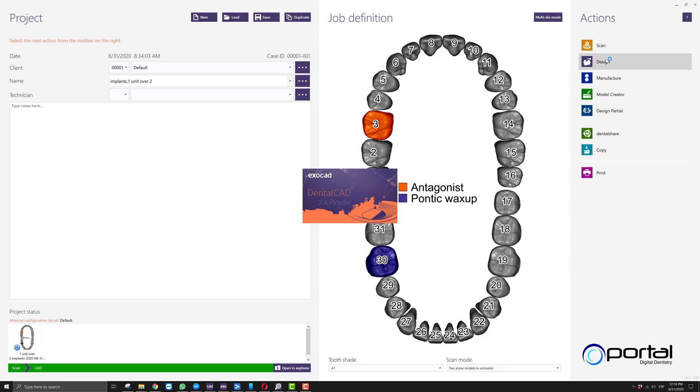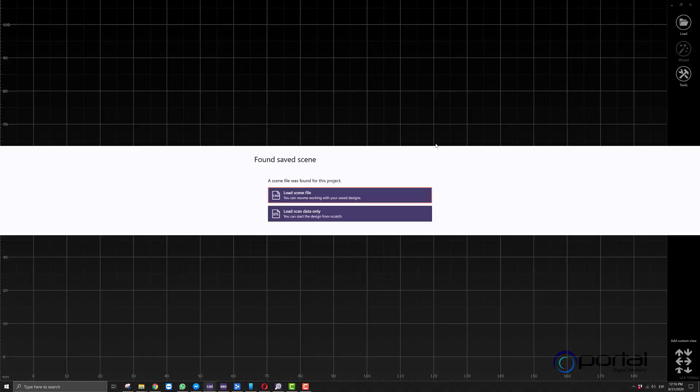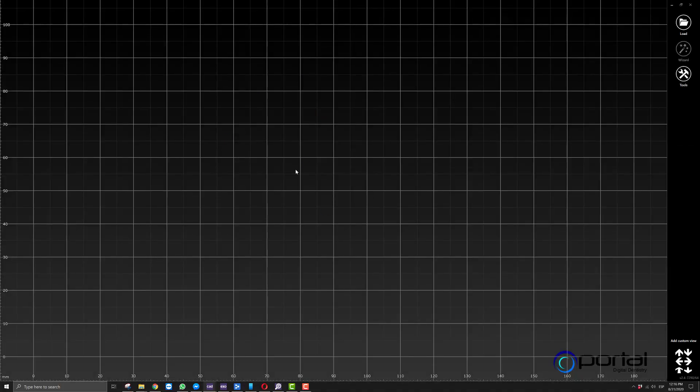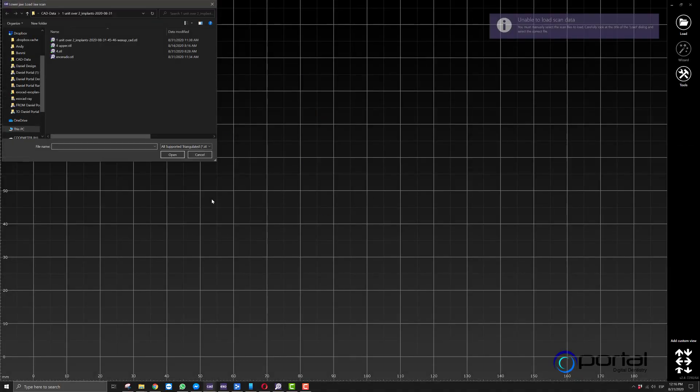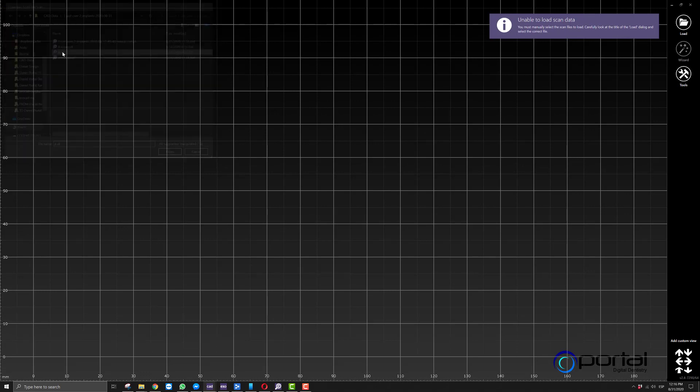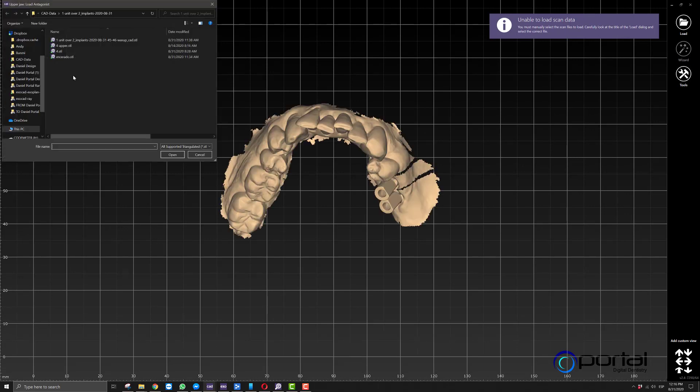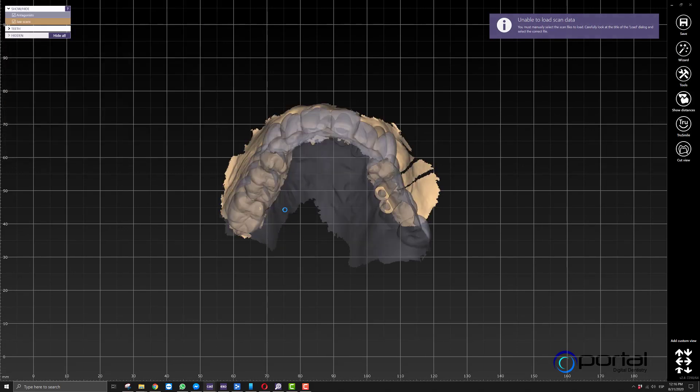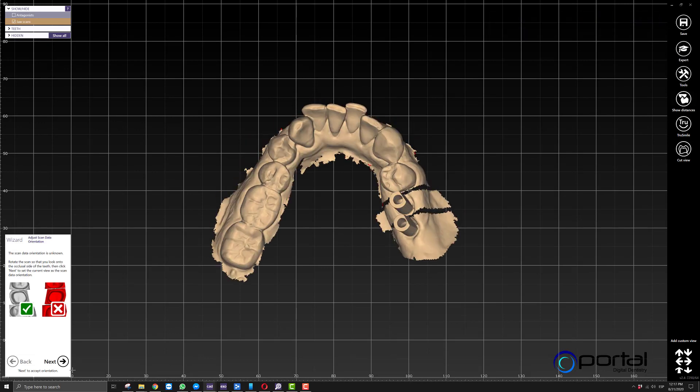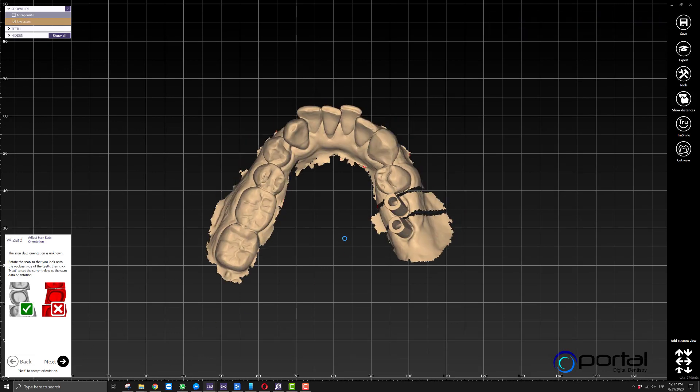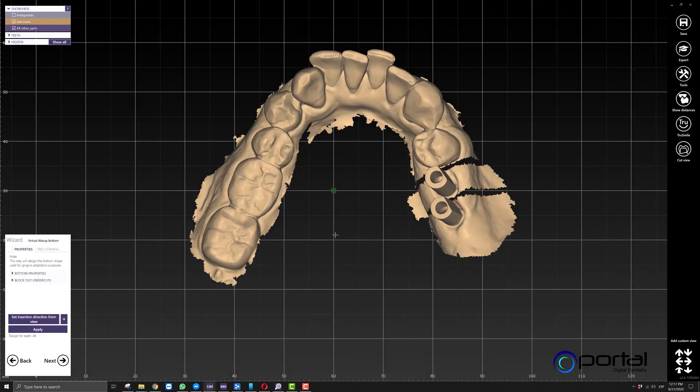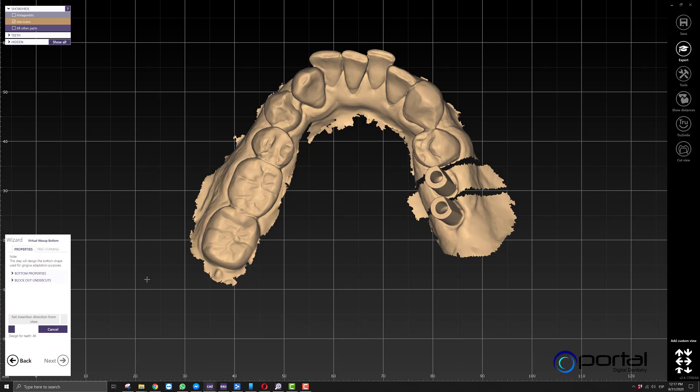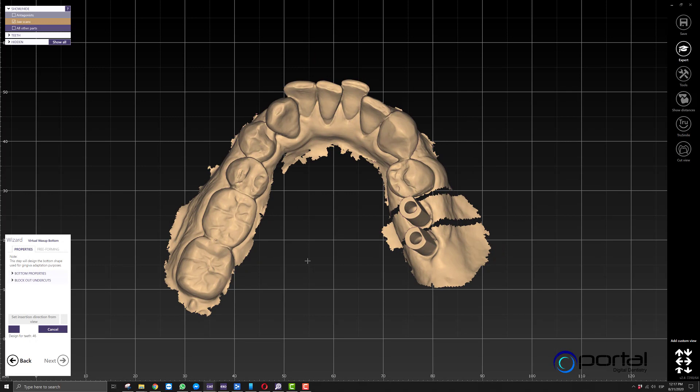In this first order, we're creating the wax up we'll use at the very end. I've already designed the case, so I'll select the lower, then the upper, and follow the workflow that ExoCAD prompts us to follow. We have to go through the virtual wax up bottom step even though we're not making any use of it. It's just part of the process.